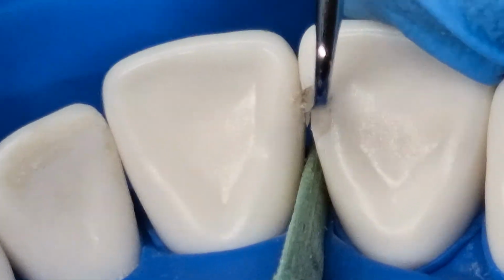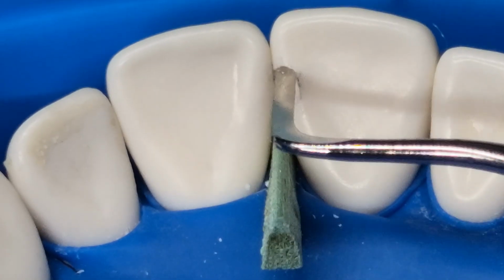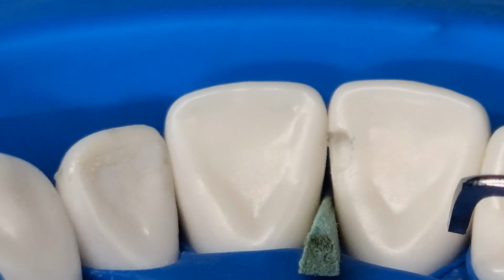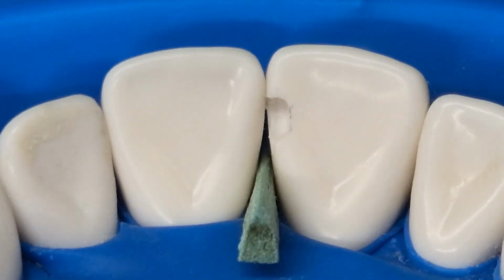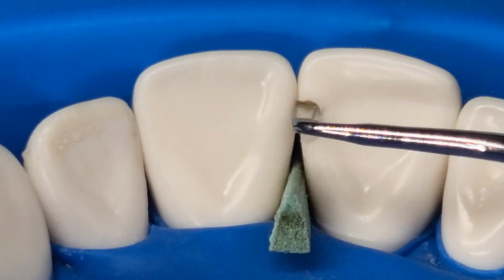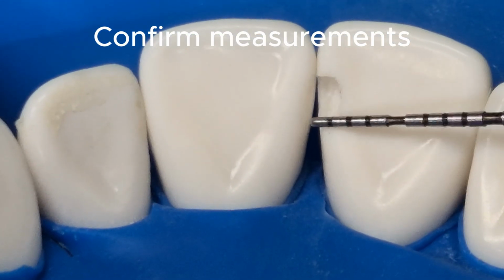Here I'm removing that enamel lip little by little, as you can see, from the palatal wall all the way down to the depth of the cavity. Now, as you can see, the enamel lip has been removed and the incisal wall is flat. Check measurements again and confirm that you have the right dimensions.